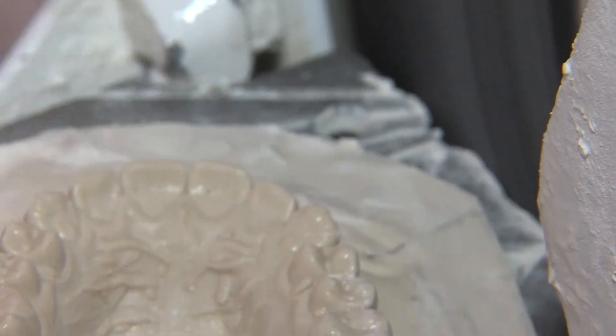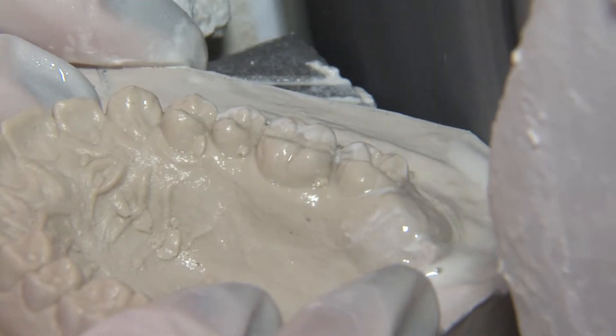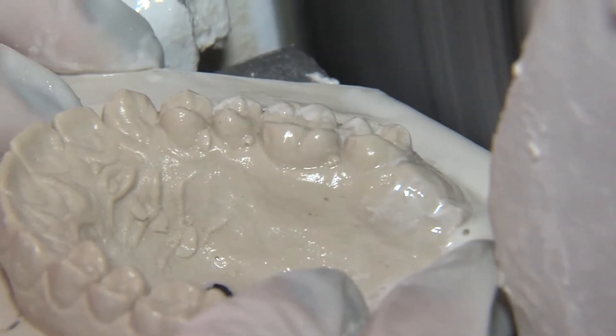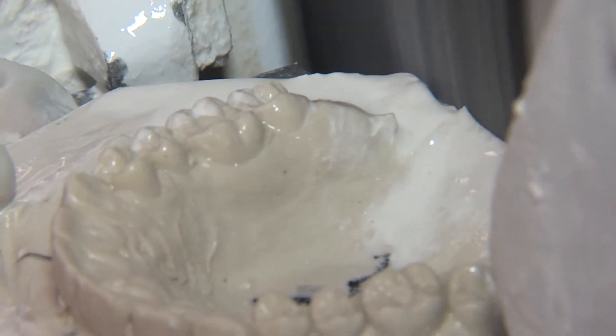Hey Kaden, what are we doing here? I'm trimming a plaster model to make sure it has all the right angles and edges. How do you trim the model? You just slide it into the blade and it circles around and cuts it down, and you have to get it wet so that it cuts smoother. Do you shape the top differently than the bottom? Yes, you round the bottom and then you point the top.